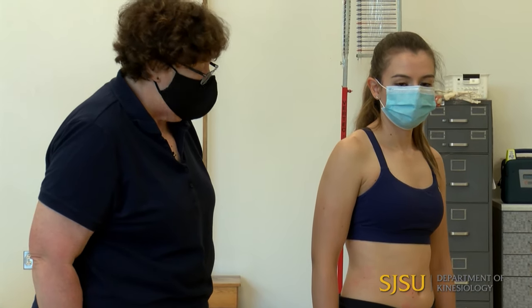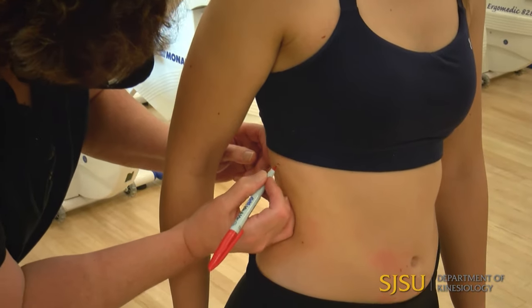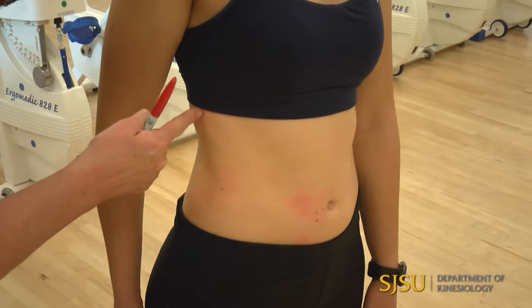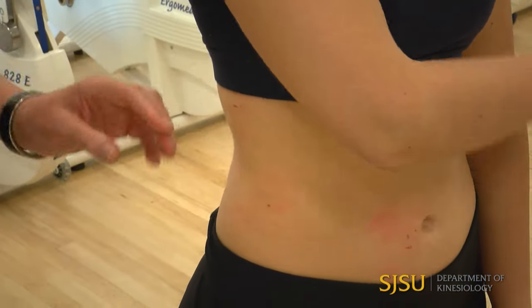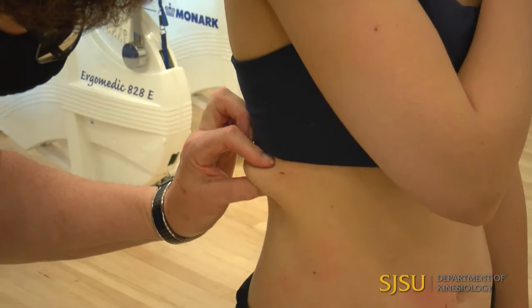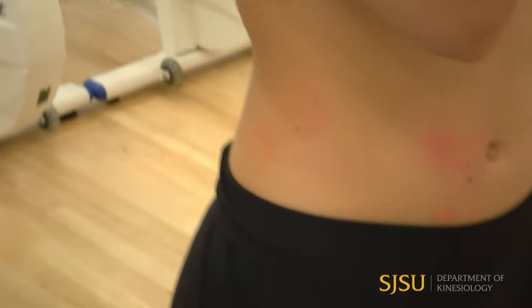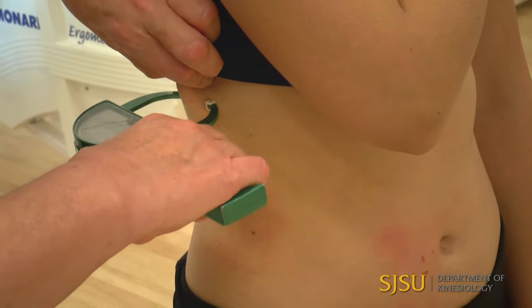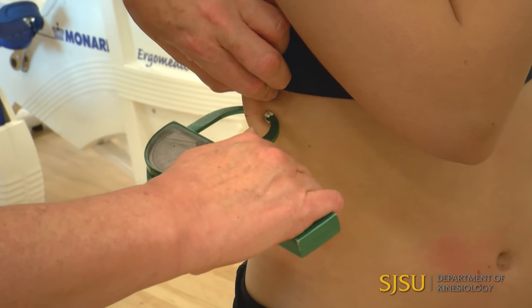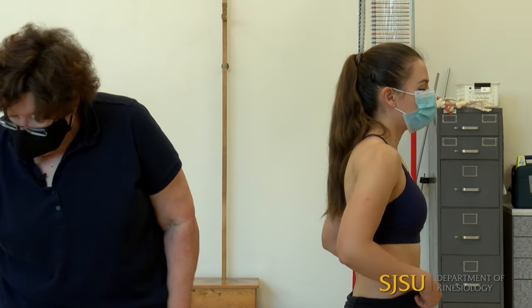Both the Jackson and standardized mid-axillary sites are pretty much right at the level of the xiphoid process. I palpate that and put a mark so I know how far up or down to go. The standardized site is a horizontal skinfold — we can move the arm forward or back to get it out of the way and pinch so the skinfold goes horizontally. For the Jackson version, same location but it's a vertical skinfold — I pinch above my mark so the caliper tips go right at the mark in a vertical direction.